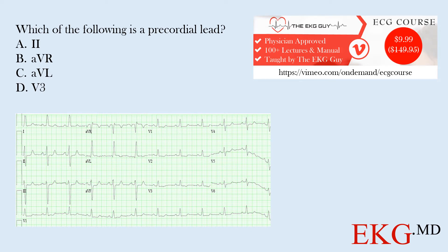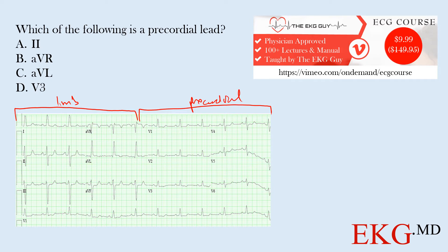Just to review our standard 12-lead EKG, we have our limb leads here on the left side and our precordial leads on the right side. At the bottom of the EKG you often have what's called a rhythm strip, which extends from the beginning all the way to the end and represents 10 seconds, whereas each of the individual leads represents 2.5 seconds.